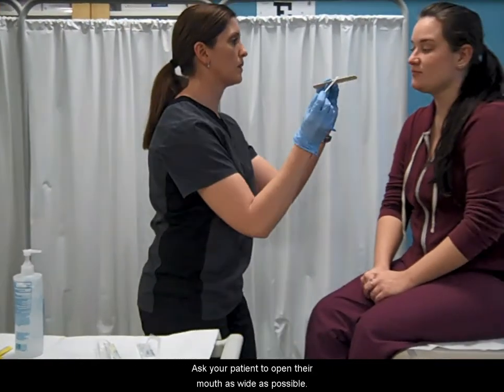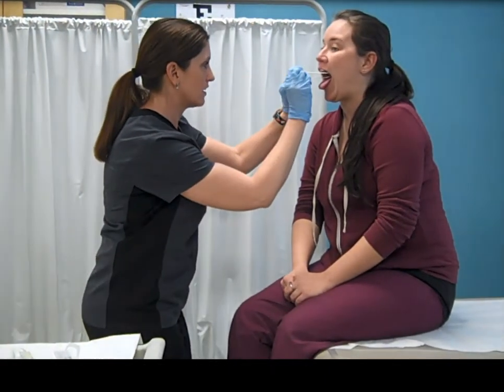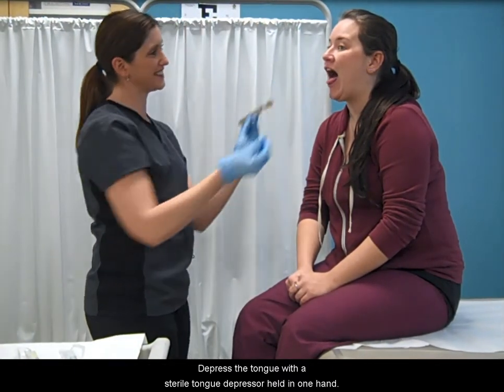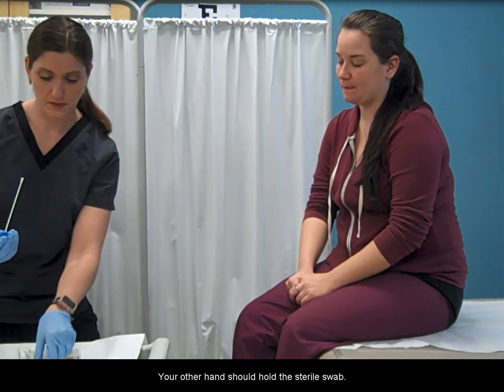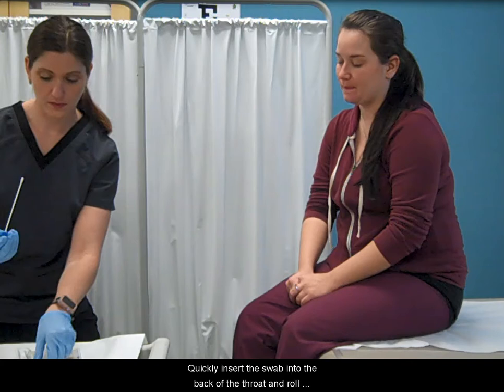Ask your patient to open their mouth as wide as possible. Depress the tongue with a sterile tongue depressor held in one hand. Your other hand should hold the sterile swab. Ask the patient to say 'ah' to assist depression of the tongue. Quickly insert the swab into the back of the throat and roll over the tonsils.